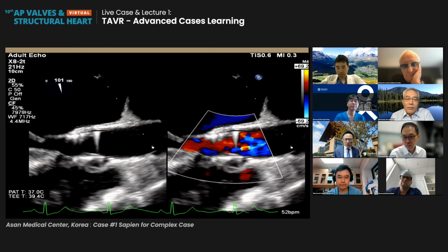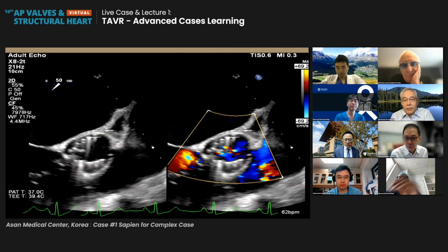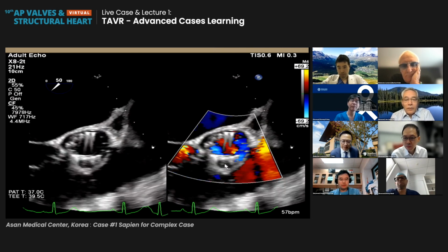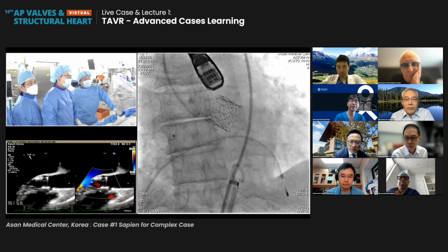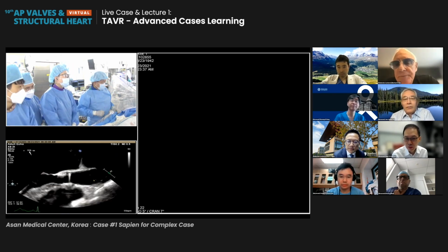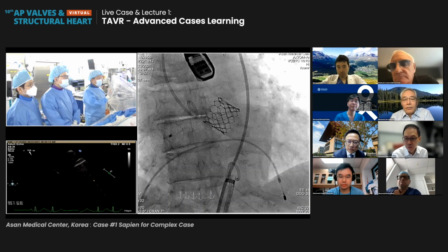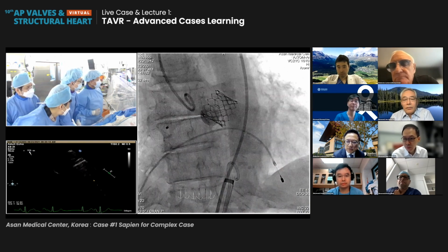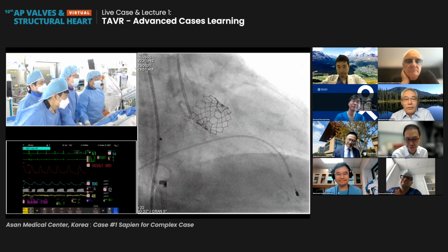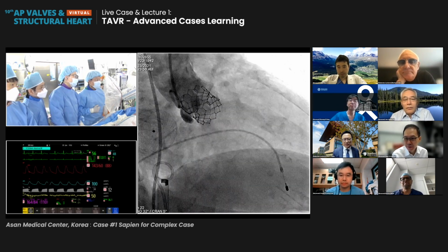I think the position is really good, all right, and the opening is quite excellent. And I think no palpable leakage here. No PVL. Yeah. Right. Very good. Great. I agree. All right. Yeah. So I want to do a final aortogram again. All right. Quite acceptable for 30 milliliters of contrast. I want to show no AR in this view. Actually, contrast again. All right.